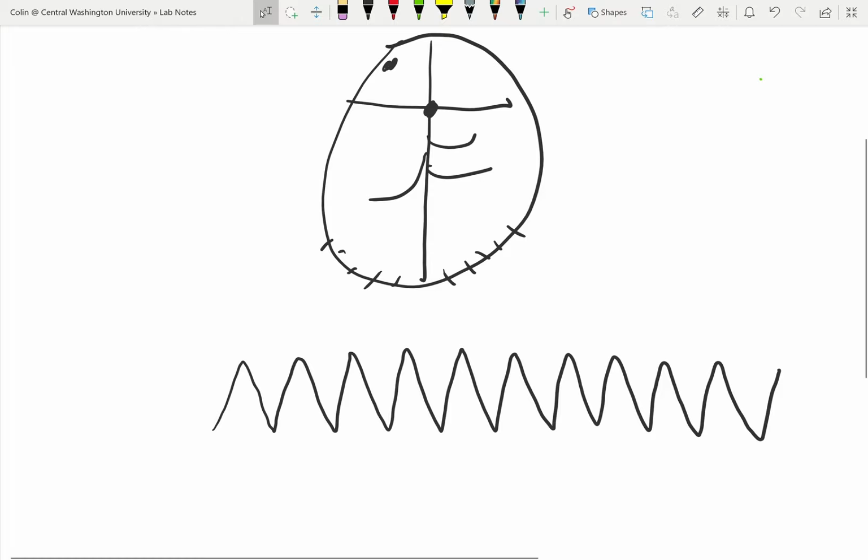People can't sustain Vtach for a long time, so if you get there and you see them in this pattern, then something needs to be done about it because they're not going to live forever in Vtach. Like someone with AFib, we talked about last week, someone could live with AFib 24/7, no problem. Vtach, not the case.